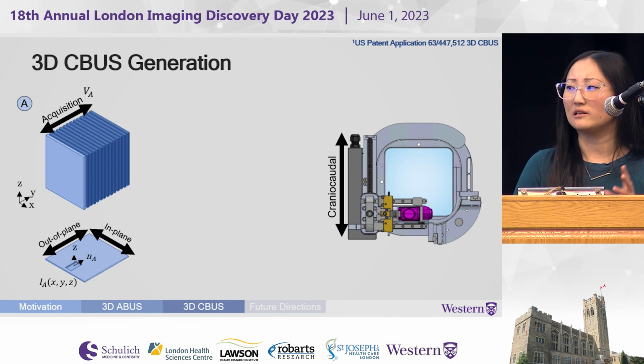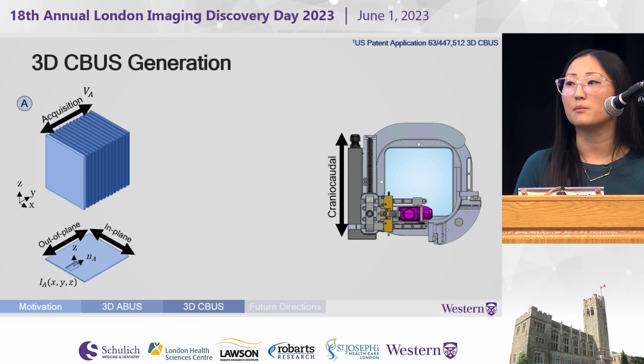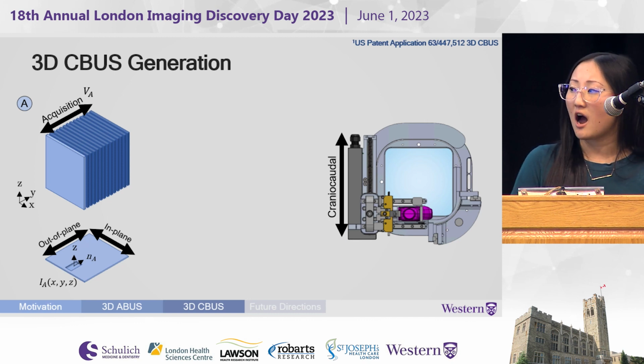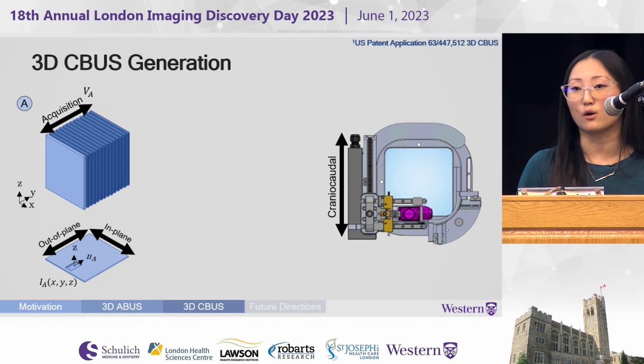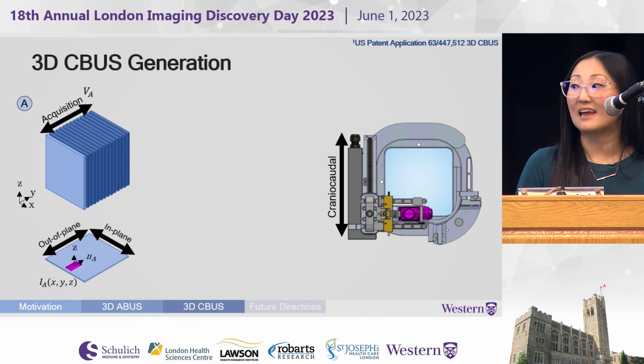So how exactly do we leverage this complementary nature and improve that resolution uniformity within our image? So this is just a simple illustration of our 3D ultrasound image with multiple 2D ultrasound scan planes and an arrow indicating its acquisition direction. And there's a coronal view plane at the bottom. So this blue volume represents a craniocaudal direction acquisition with its normal pointing along the y-axis. And here we see an anisotropic voxel based on its high in-plane and poor out-of-plane resolution.